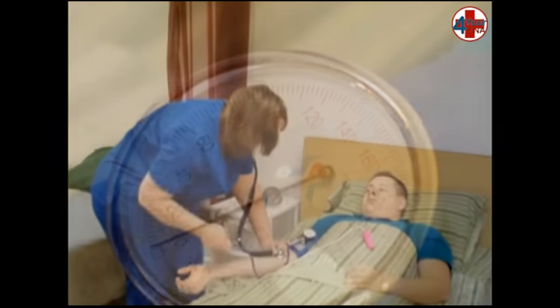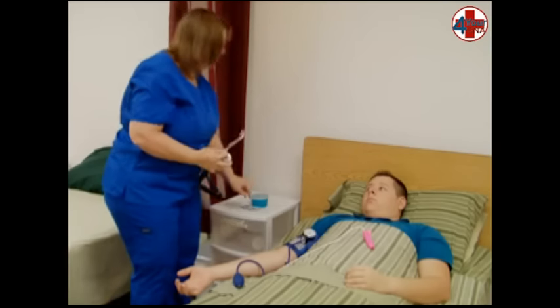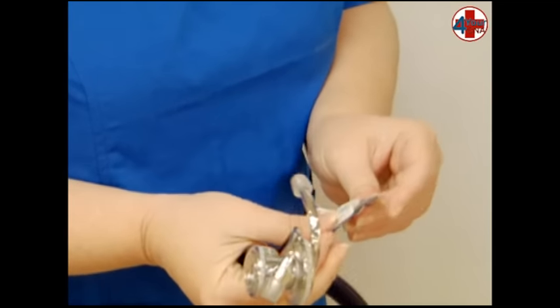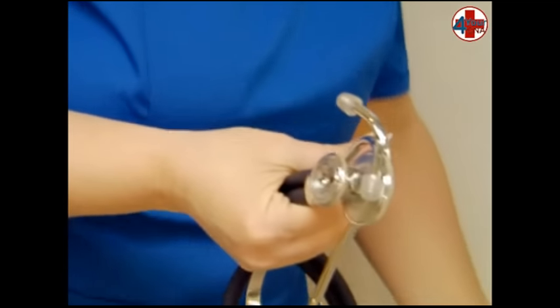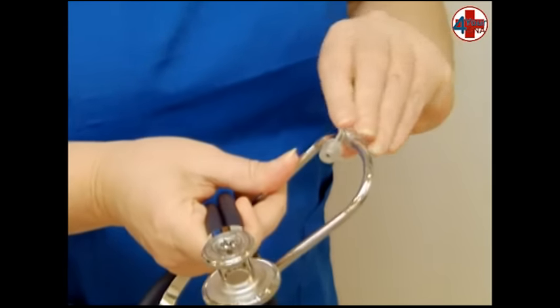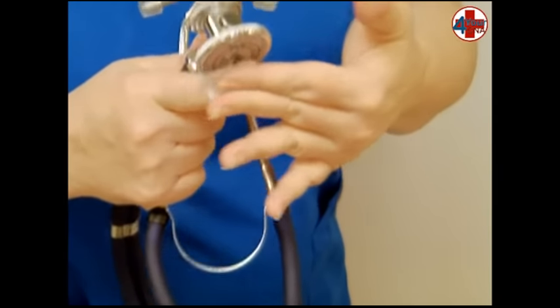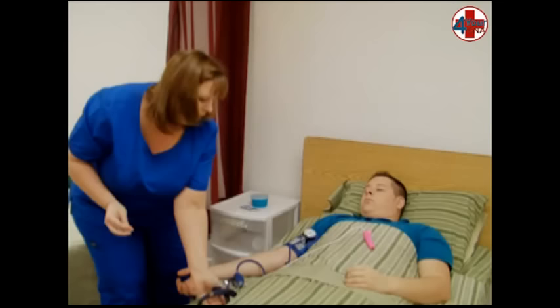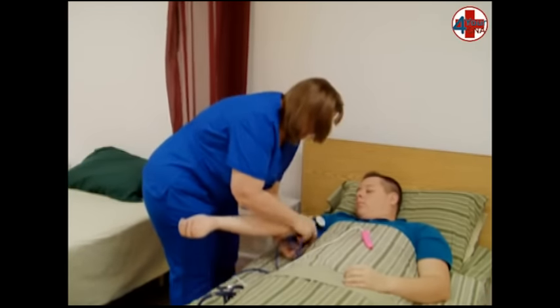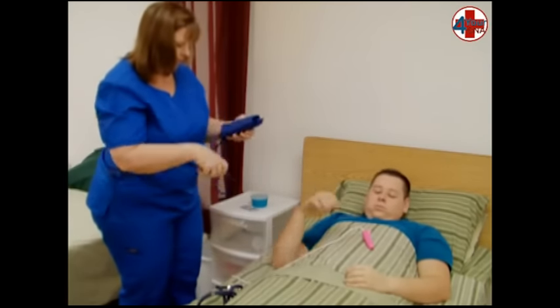When the needle reaches zero, remove the earpieces from your ears, open an alcohol swab, and wipe off each earpiece and the larger diaphragm, then throw the alcohol pad away. You will need to clean the evaluator's earpieces as well. Remove the cuff from the patient's arm and roll for storage, making sure the cuff is completely deflated.